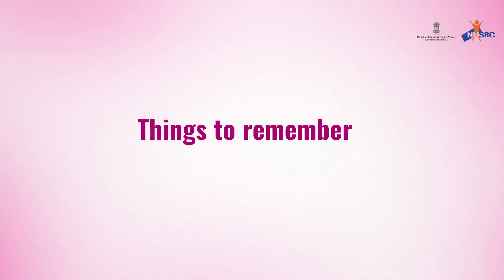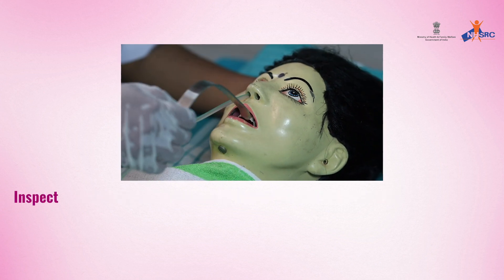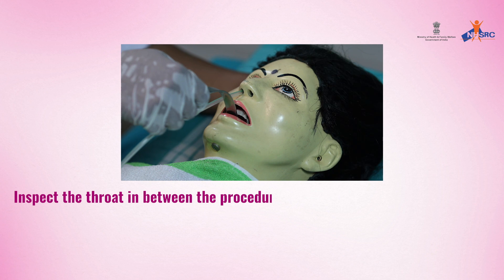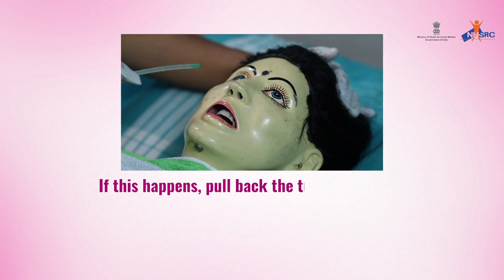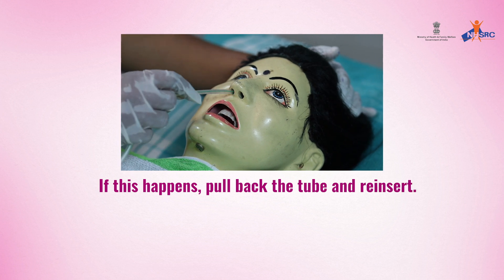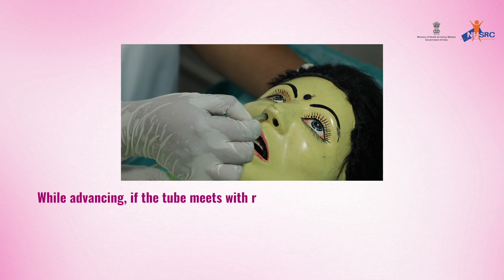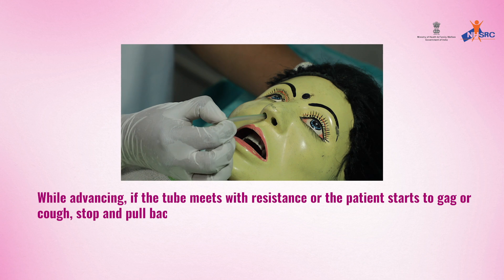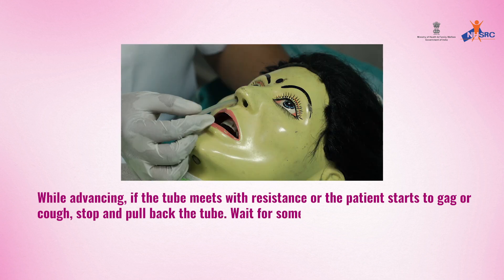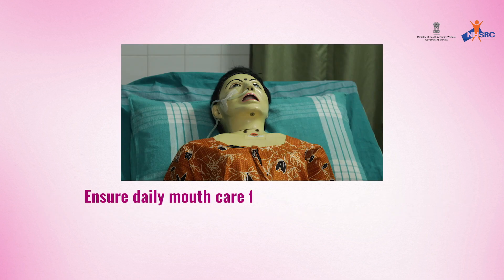Things to remember: the nasogastric tube may coil in the throat or mouth. Inspect the throat during the procedure using a tongue depressor; if this happens, pull back the tube and reinsert. While advancing, if the tube meets resistance or the patient starts to gag or cough, stop, pull back the tube, wait, and then reinsert. Ensure daily mouth care for the patient on Ryle's tube.